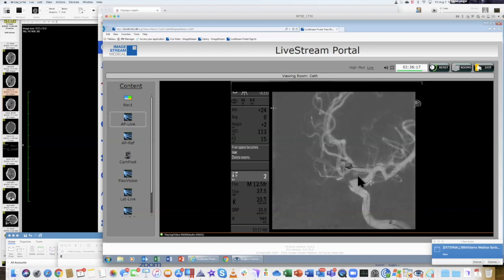Getting closer now. He's advancing the last little bit here. You see it's getting a fair amount of resistance. This is the scary part. I mean, the more you push, the higher the risk of a rupture.